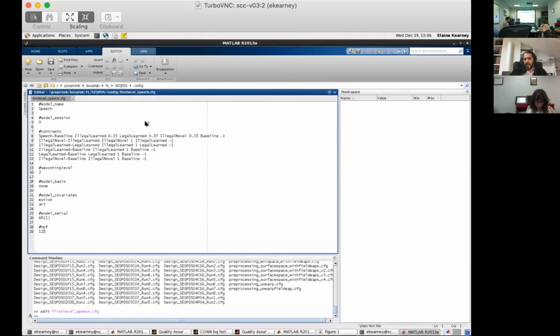So outliers in the max motion measure, we don't care that much about as long as we are running ART and making sure that we are removing those actual individual time points where there was excessive motion. But an outlier in mean motion is more problematic, because perhaps we haven't removed that many time points and the average motion of that subject is large.